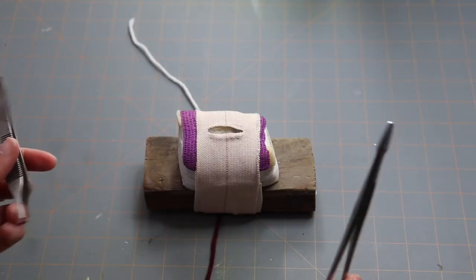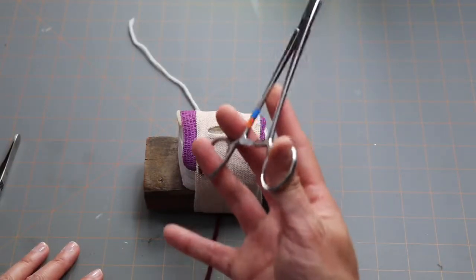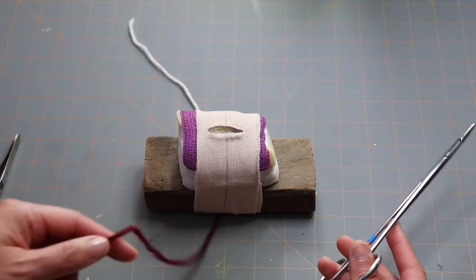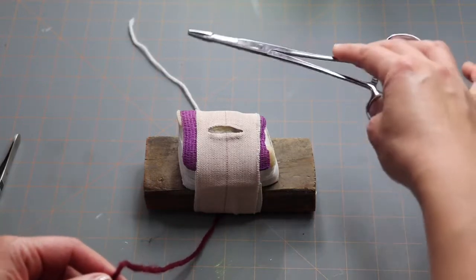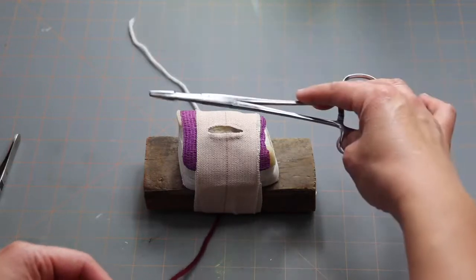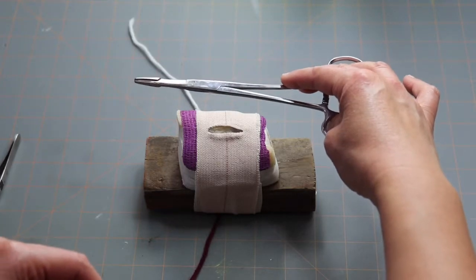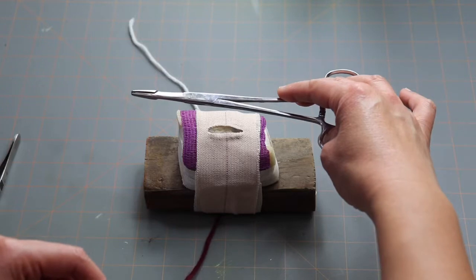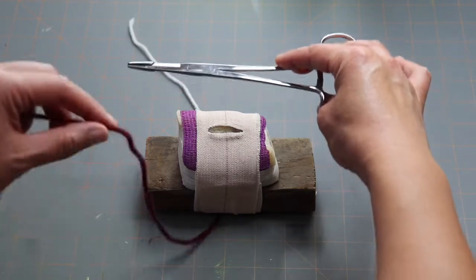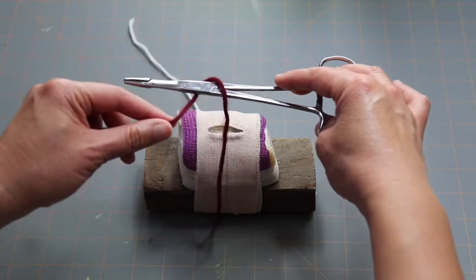Now I'm going to show you how to do the throws. Put down your thumb forceps. You'll need your needle holders in your dominant hand, and with your non-dominant hand you'll pick up the suture closest to you — for me that's the maroon suture. You're going to start with your needle holders above your incision — I call this the inside. You always do four throws for a proper knot, depending on the type of suture. You're going to wrap your maroon suture over and around the needle holders.